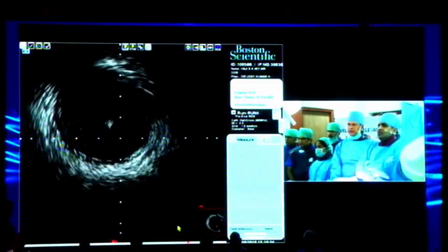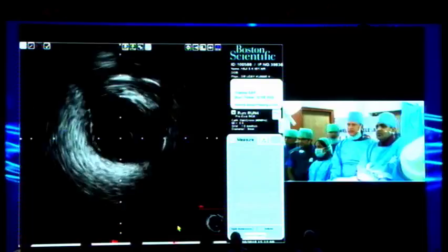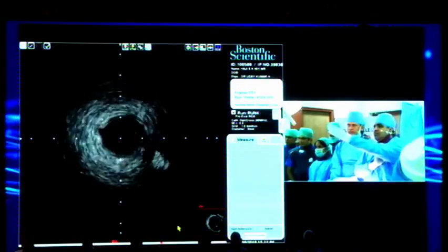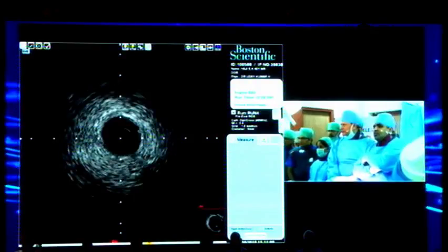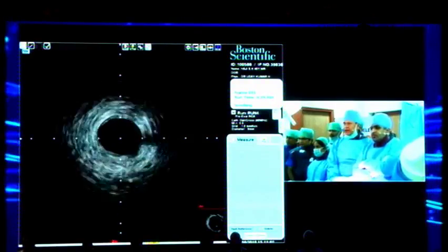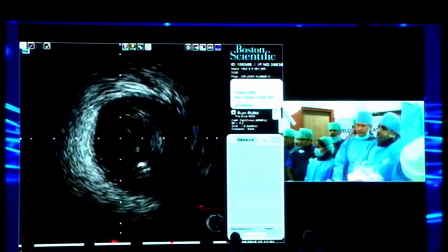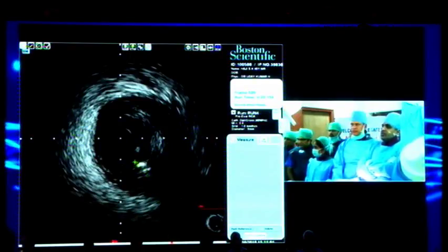This is in the guiding catheter. I think it's around 5. When you punctured the proximal CTO cap, was the IVUS catheter there, or did you do it after that? No, after that. Here you can see the two wires, a little bit forward. Backward, please. A little more. You can see that our wire is already in the correct place of the puncture.